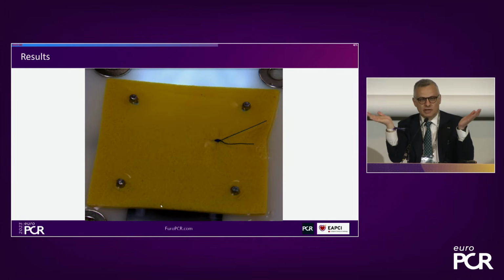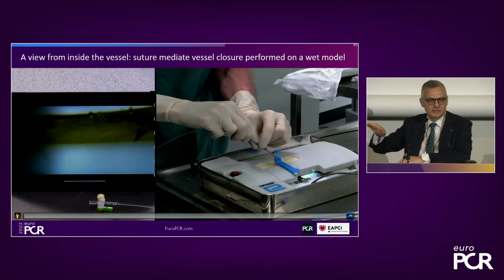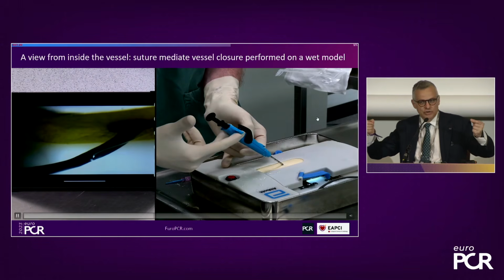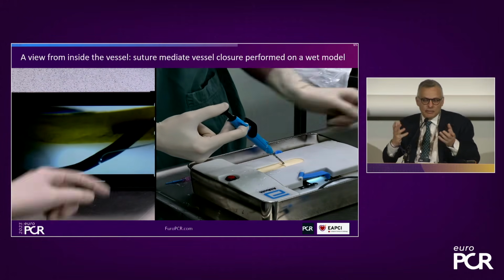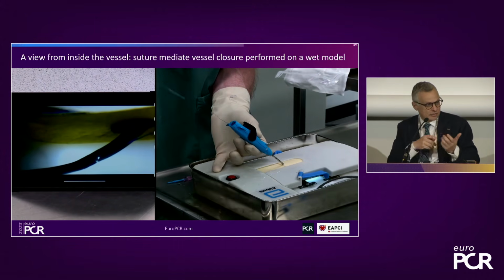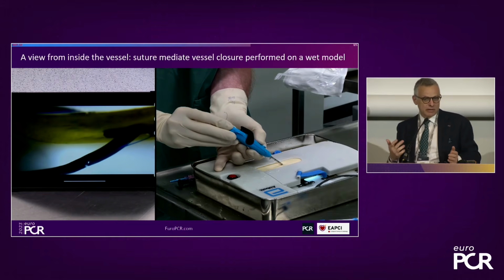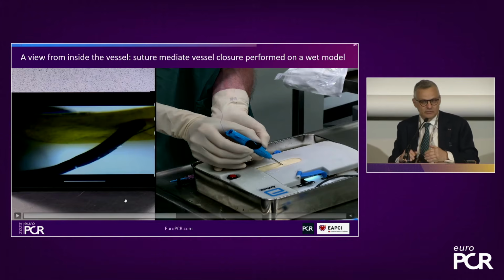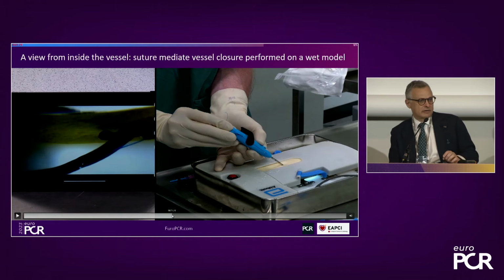So if you keep this more down, like 20, 30 degrees, you will not really puncture far enough from the edge of the opening, and this will reduce the ability of the suture to close. It's just a little detail, but please think about it. Think about the importance of being coaxial to the vessel, which means usually you go towards the belly button, okay? Because the arteries are going towards the middle of the body, and 45 degrees. If you do this, this is a really effective device.